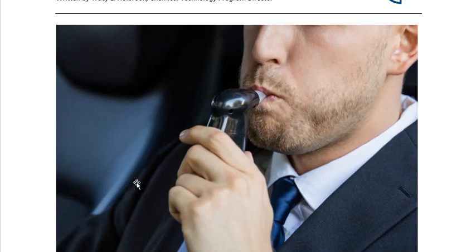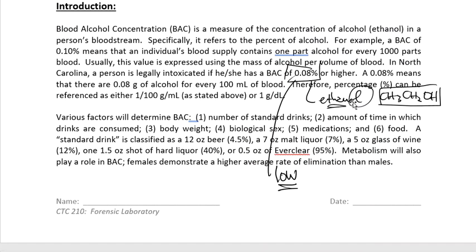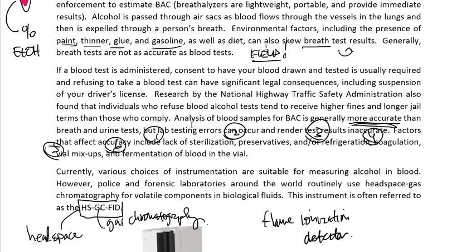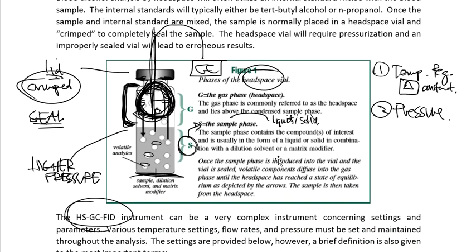They're going to ask about different processes and different things that you need to take away from this blood alcohol content lab. So review some of the terms about the equipment. I want you to review what BAC actually is. What kind of molecule are we looking for? We need to look at, in the diagram or the picture here of the GC instrument, some of the pieces and parts that we've talked about throughout this lecture. Can you explain those on your own? Can you explain that to someone else maybe who has never done it so far? If you can, then I think that you'll feel pretty good on the pre-lab questions.